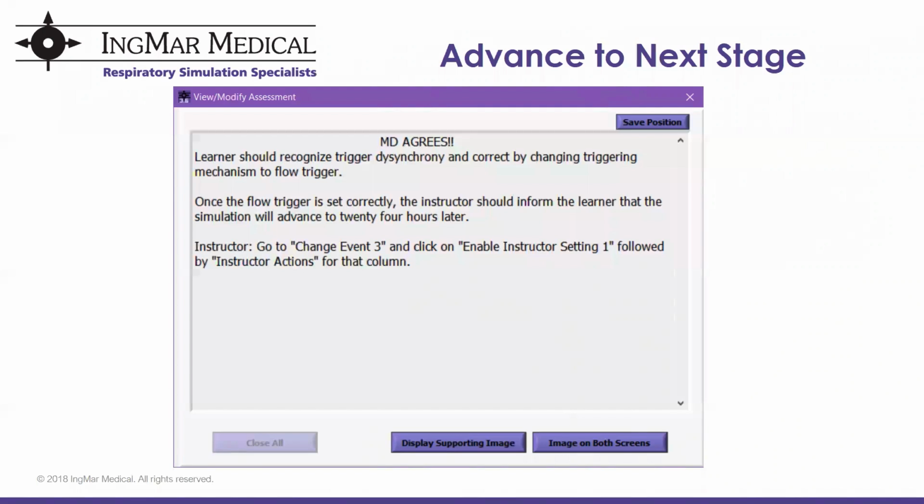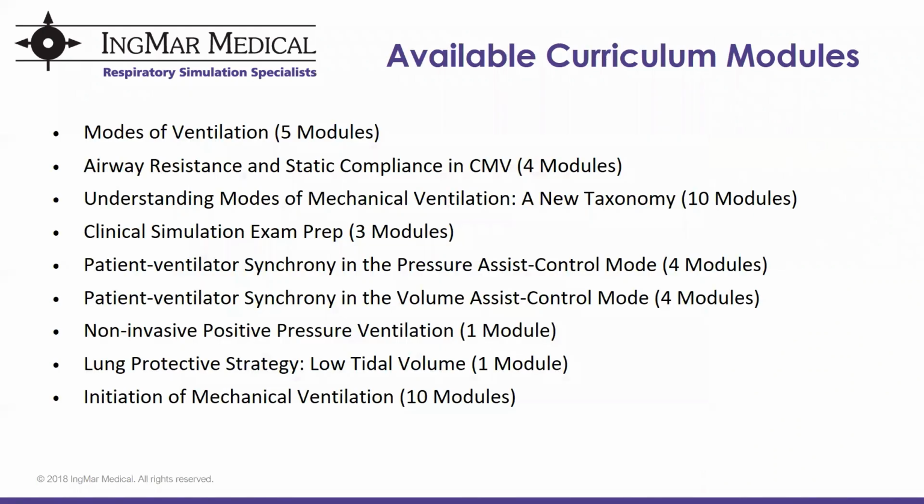So as I mentioned before, we were really focusing today on that one very specific stage, stage number 2 of this particular curriculum module. But we do have over 40 total modules available for our users, covering a range of topics common to mechanical ventilation training. These modules are built by our clinical educators, who are respiratory therapists themselves, and we also work with leading educators in the field of respiratory care to develop scenarios that are aligned with our customers' needs.